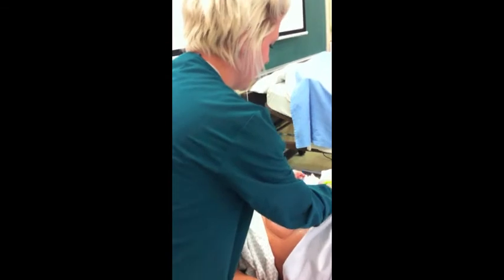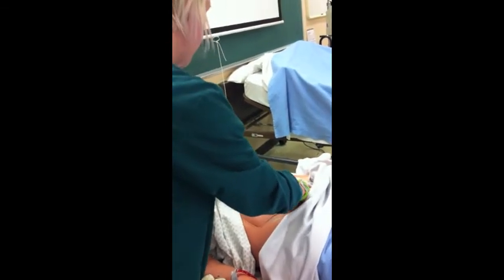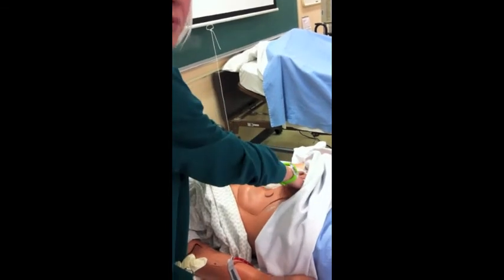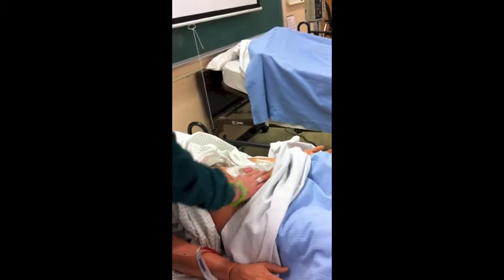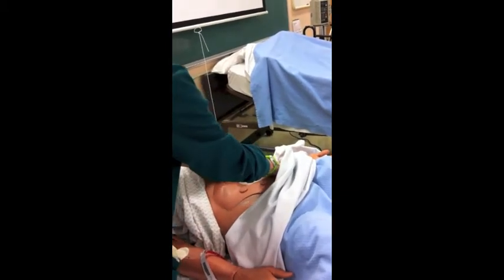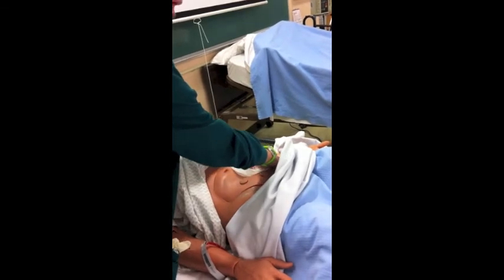I'm assessing the stool in the bag that's present. I'm asking my patient at the same time if there's any pain present whatsoever, and she's denying that there's any pain while doing this. Assessing the stool in the bag, there's a moderate amount of brown stool. It's formed, which is a good sign.